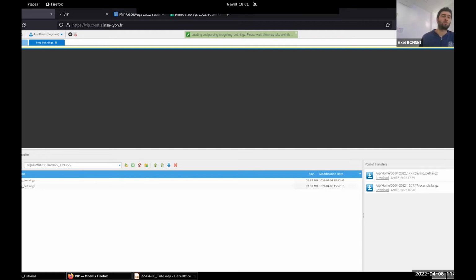This visualization is available for different image formats. It is very convenient when users want to have a quick check on the results to verify that the result is the one expected. For more profound processing, they can download and process them in their favorite tool. I think it is maybe taking too long.